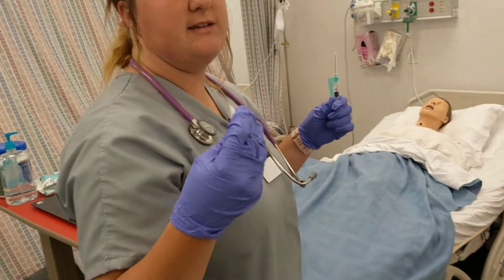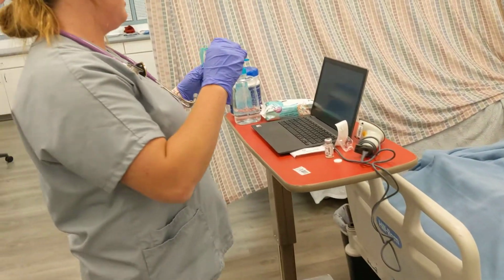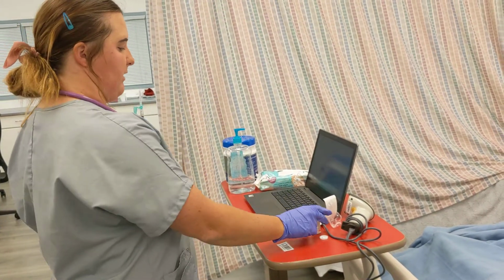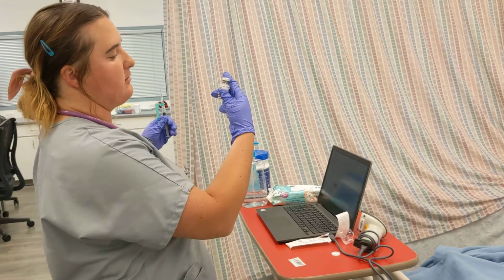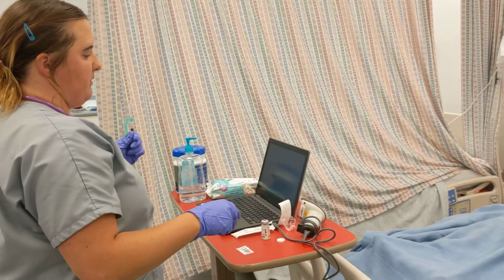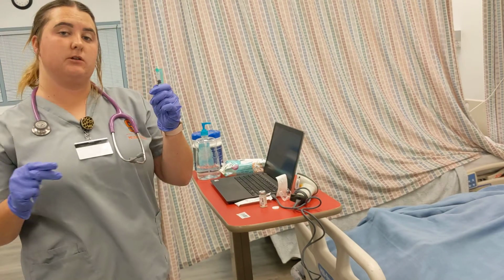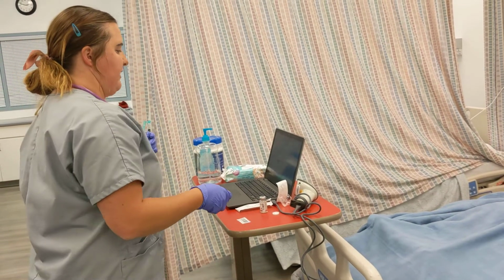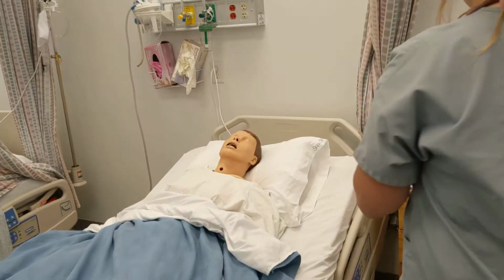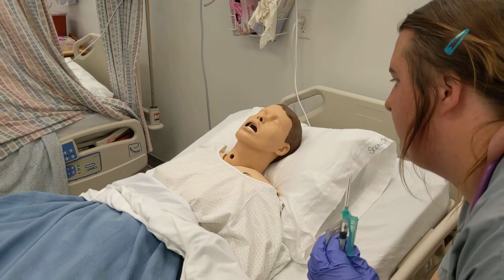And I'm going to do my second check right now before I go give it. So we have our right patient here. We have Esther here. So we have the right patient. We have the right drug. We have drawn up ketorolac tromethamine, and that's what we have on the chart. We have the right dose. We've done the math. It is 1 milliliter that we are giving. The route is intramuscular, which we have drawn up. And the time is right now. So I'm going to go over by the patient's bedside. I'm just going to set them up to a comfortable height for both of us.